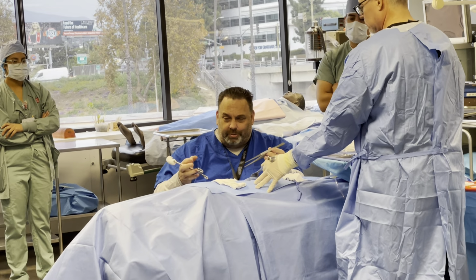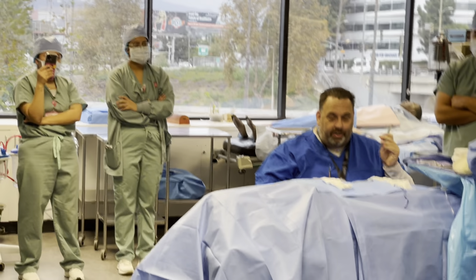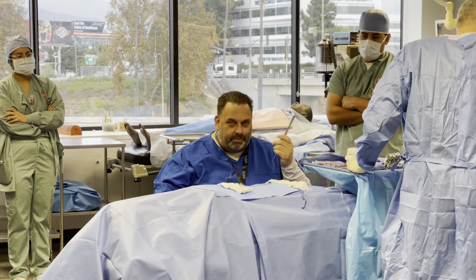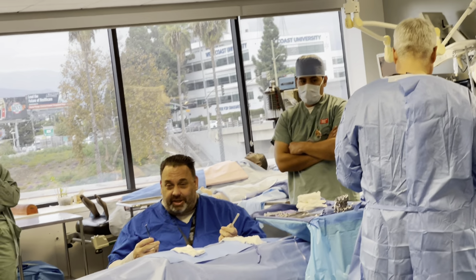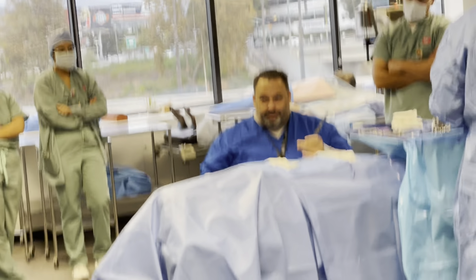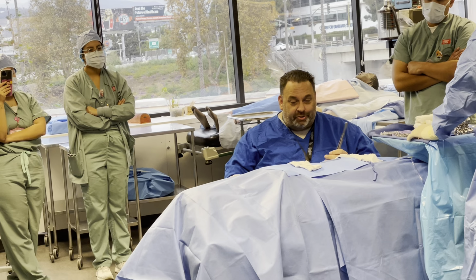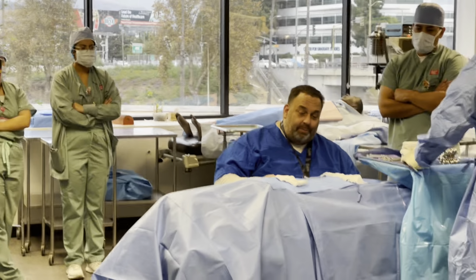So, what did he hand me? He gave me pickups, right? Whenever you hand off a suture, you must hand off pickups. Start thinking things go together like peanut butter and jelly, okay? So whenever you do a suture, you should be thinking pickups, right? And after that, what else should you be thinking? What comes after suturing? Cutting. Scissor. Suture scissor. Okay? So right now, I'm closing the abdominal cavity up.